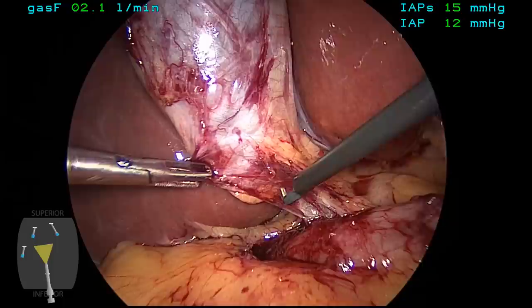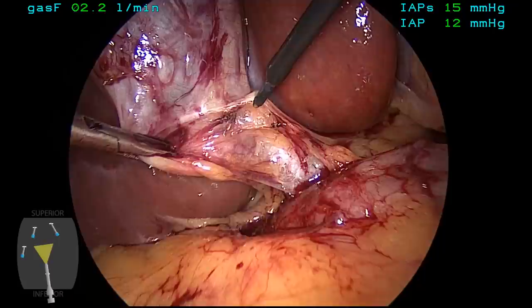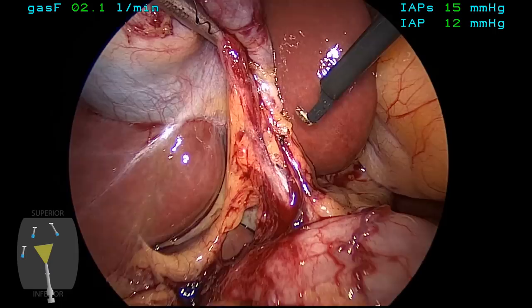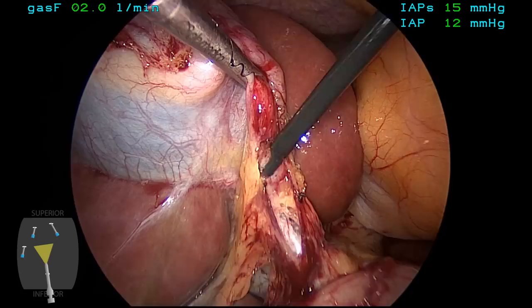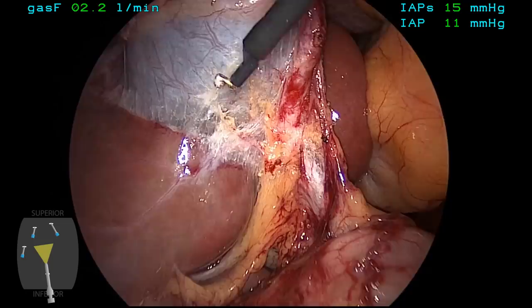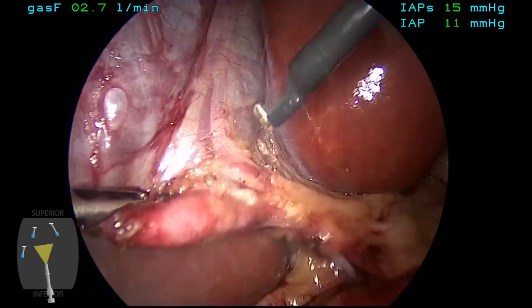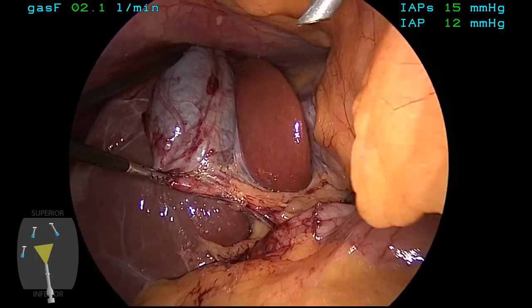The neck of the gallbladder is then grasped and retracted laterally and inferiorly to open up the area of the hepatocystic triangle. The L-hook is then used to gently incise the peritoneum and develop this envelope going up along the medial side up towards the liver bed. The gallbladder is then retracted medially to expose the dorsolateral aspect and the peritoneum there is also gently divided with short bursts of energy to expose the lateral posterior aspect of the neck of the gallbladder. One can already see the cystic artery and you begin to get a sense of the location of the cystic duct as well, just lateral to that.